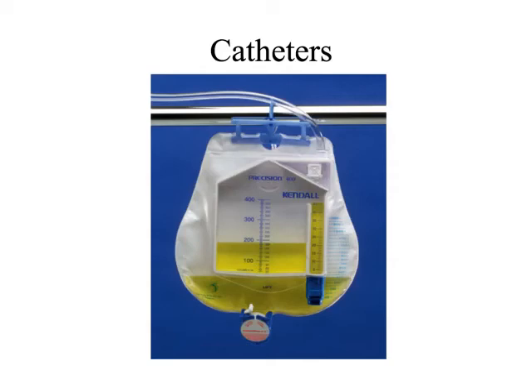If you're more mindful than I am, feel free to use the one that's on the catheter. Does that make sense? You want to make sure that you, especially, CYA, and knowing what we know about contrast, that it's being excreted through the urinary system, I don't want to impede that flow any longer than I need to. But having an indwelling catheter will actually reduce the diagnosticity of doing the delay scans, like the kidneys and bladder delays. Questions about that?